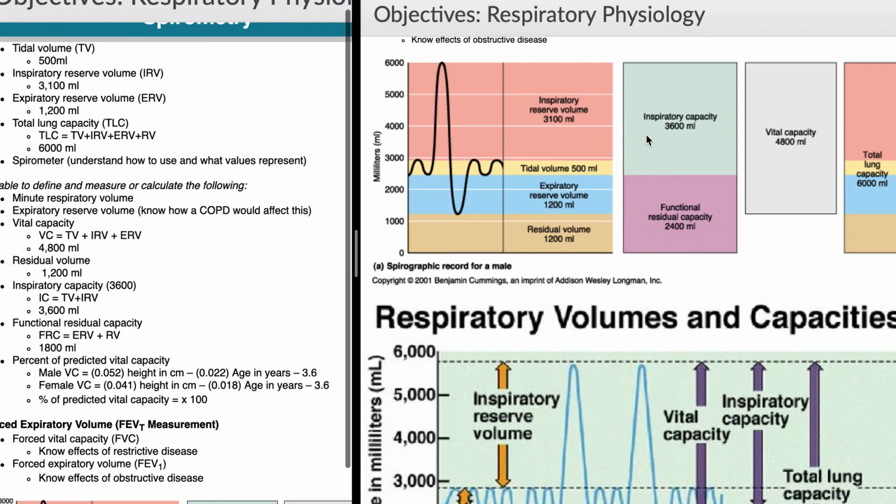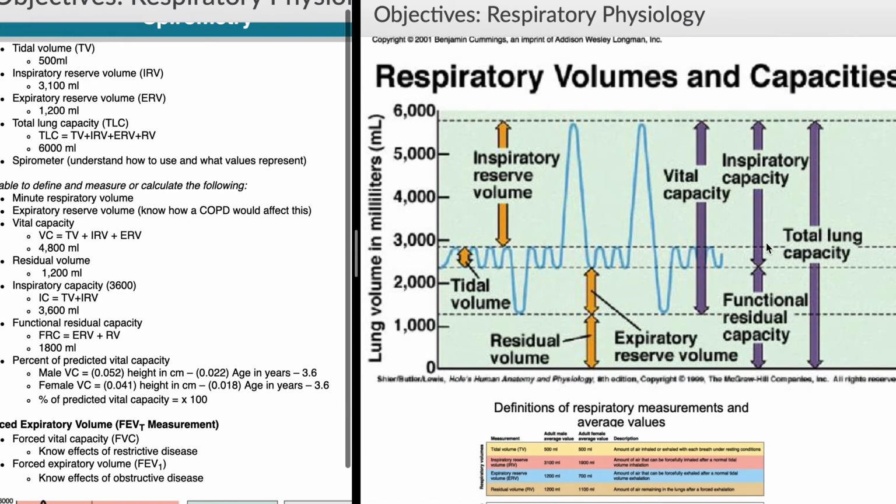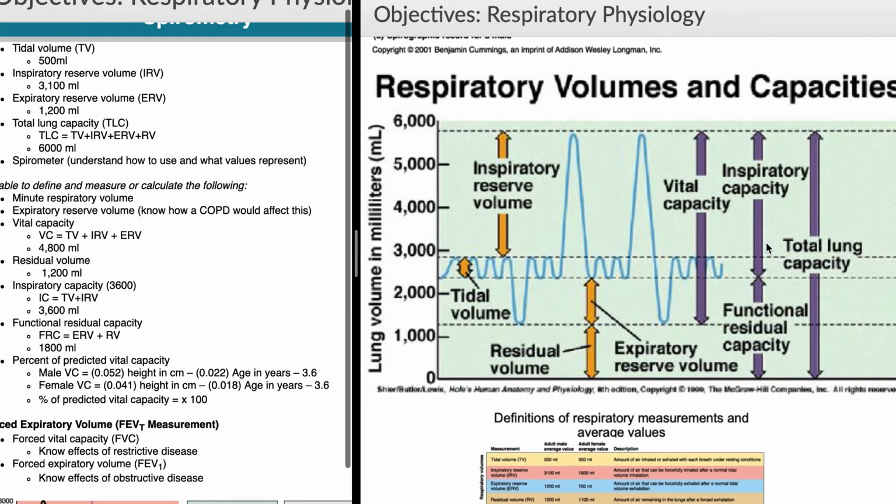All right, so that's spirometry. So the second chart gives you a chance to go through it again. What I encourage you to do is pause the video now and go through this new chart and walk through it and see if you can explain it to yourself and act it out as you breathe it. So here's your shallow breathing, your normal breathing, and then you blow out as much as you can. Normal breathing, normal breathing in as much as you can. Normal breathing in. Out. Sorry, no, I was right in the first place. In, out. And so then the yellows are our volumes, and then our purples over here are our capacities. So try to walk through those.